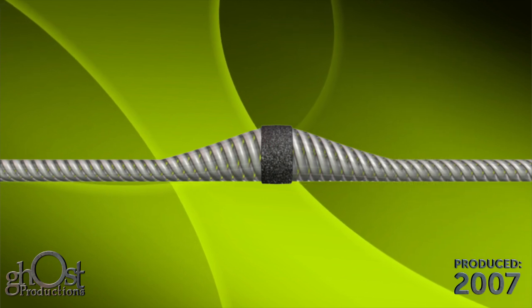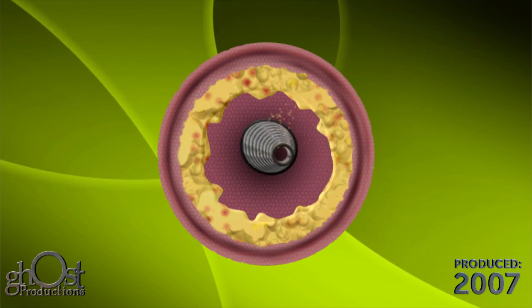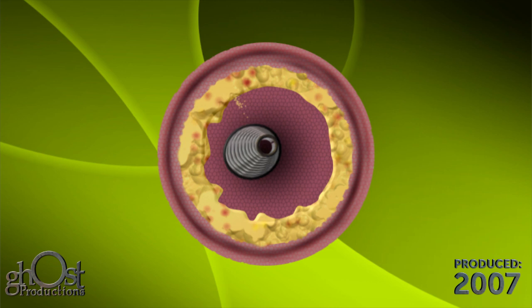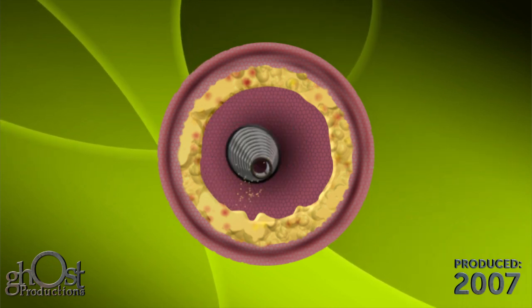The Diamondback 360 device orbits using centrifugal force to push the crown out against the lesion. Increasing centrifugal force increases the orbit, creating a smooth lumen approximately twice the diameter of the crown.